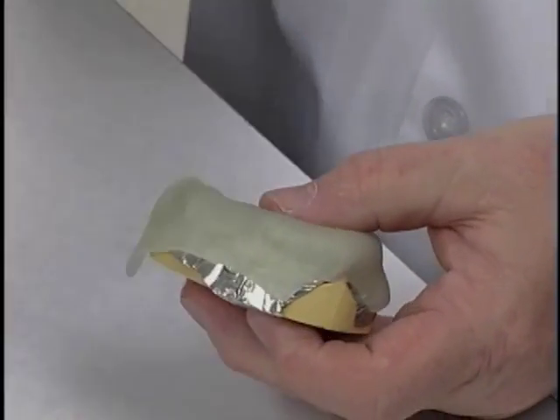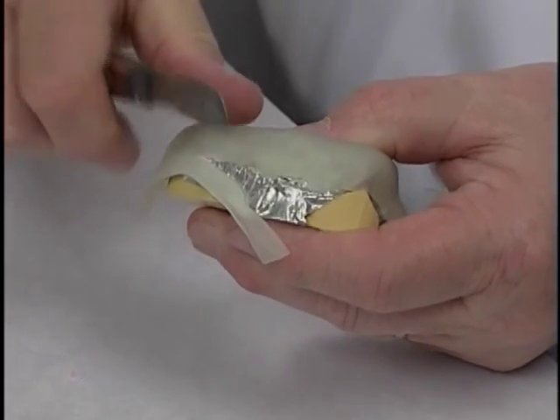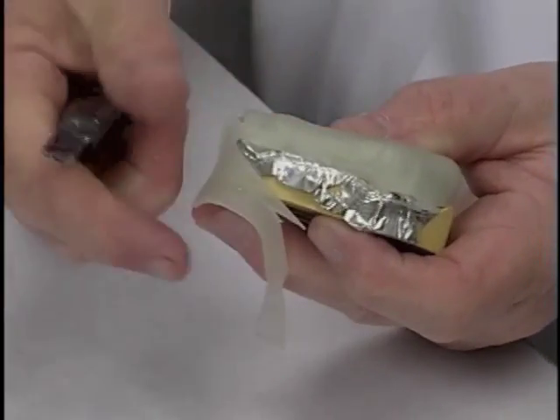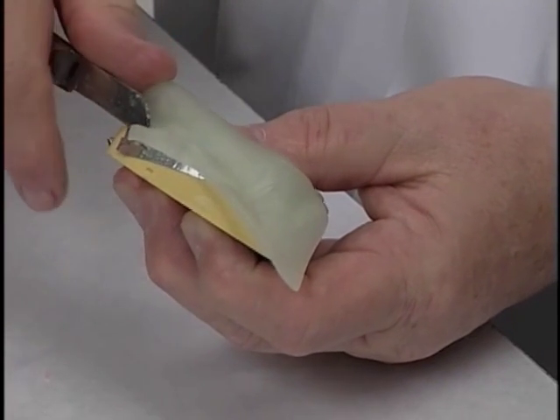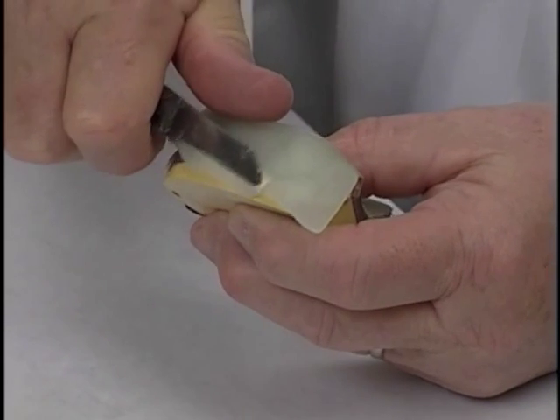Then we can take a knife, cut the excess material from it, and we're going to save that material for just a little bit because the excess material we have is going to be used to form a handle for the tray.